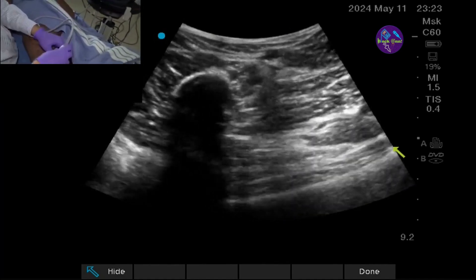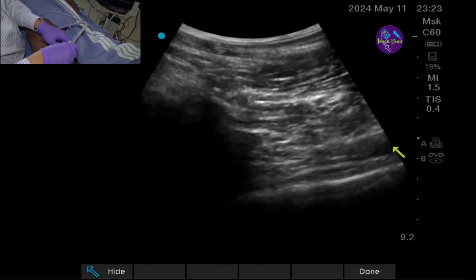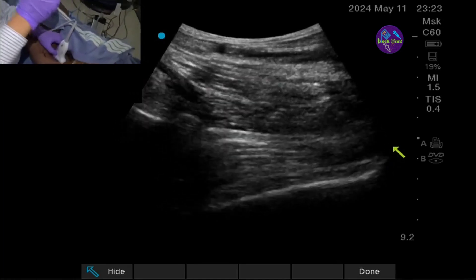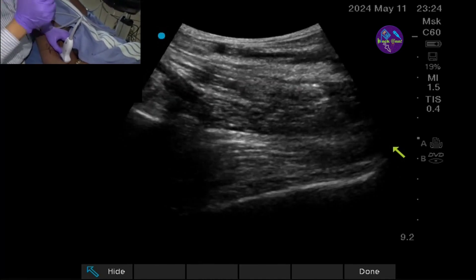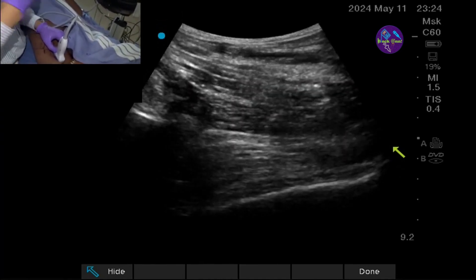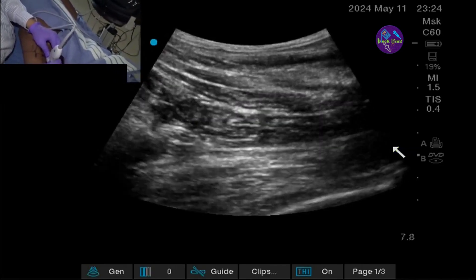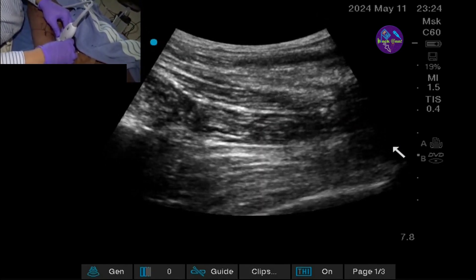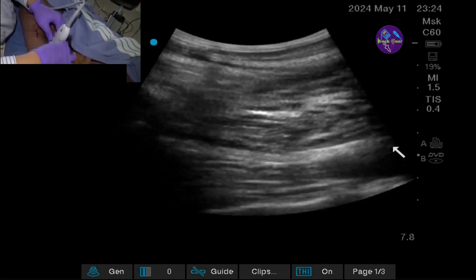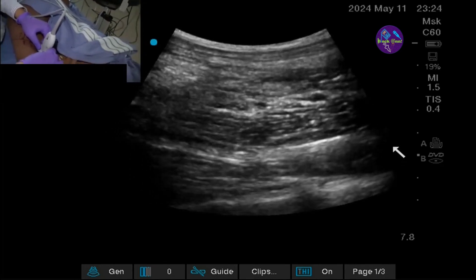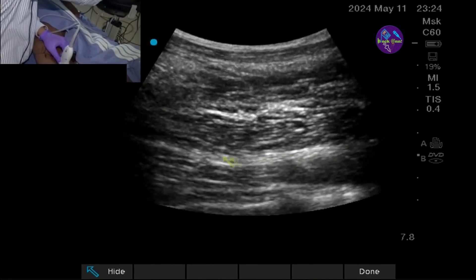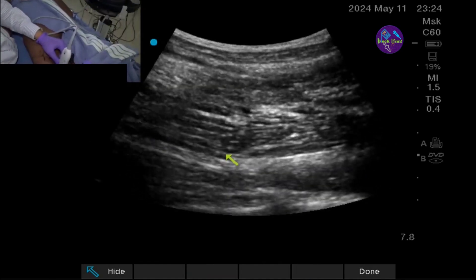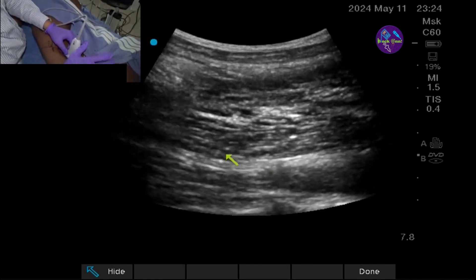If you rotate the probe 90 degrees, you can see long cable-like structures — the longitudinal view of the sciatic nerve. If you have difficulty identifying the nerve in short axis due to the many overlying muscles, you can confirm it with a longitudinal scan. In this view you can see the nerve clearly along with the paraneural space. You can scan above and below, and the entire screen fills with the sciatic nerve. You can also insert the needle and block in this longitudinal view.